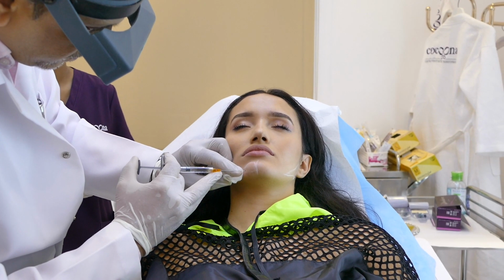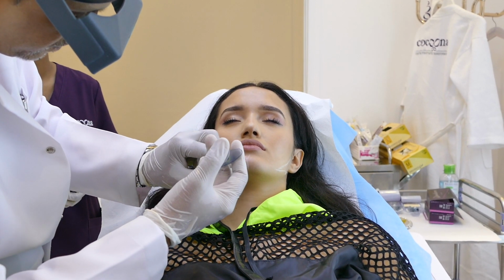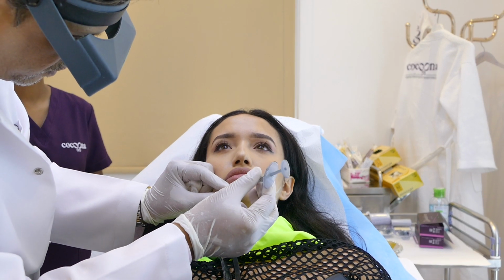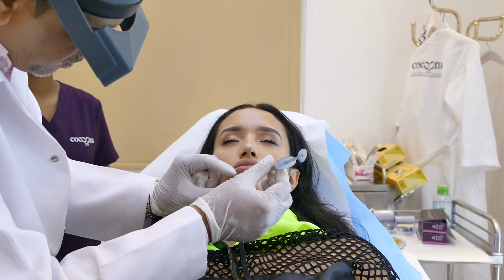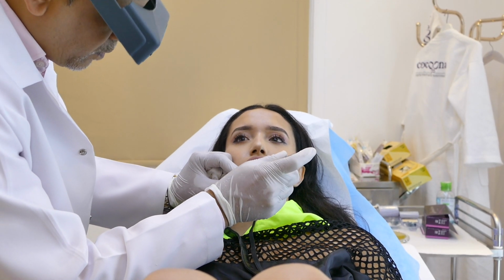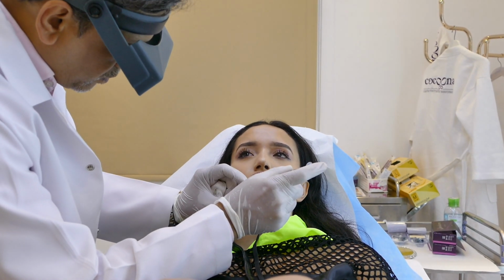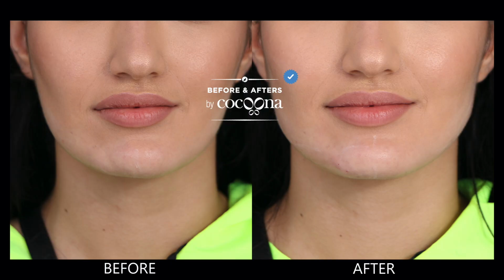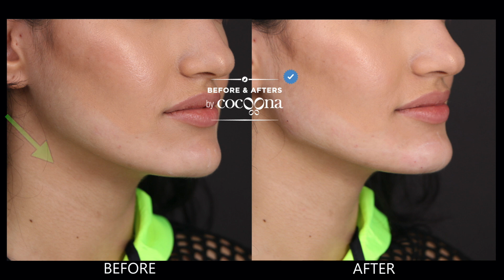I have placed another insertion point at the pre-jowl area to go retrogradely to inject into the lower border of the mandible posterior part. A very gentle movement allows atraumatic injection, and this is how we have increased the vertical height of the ramus of the mandible and the chin.